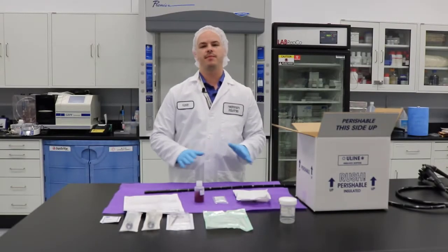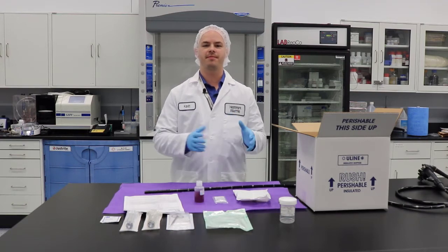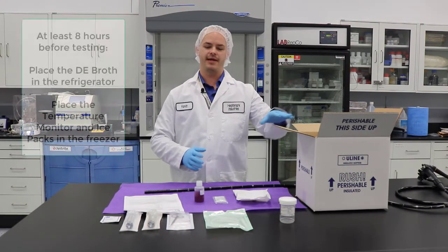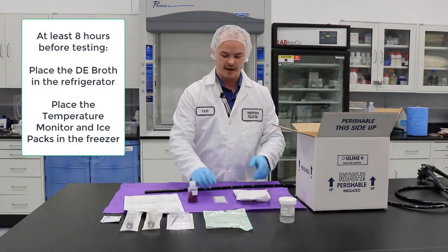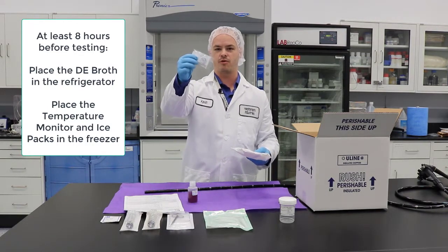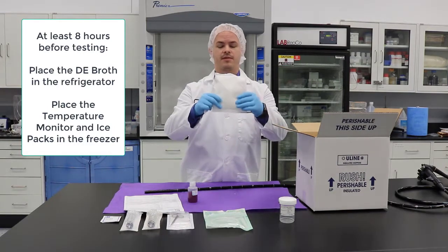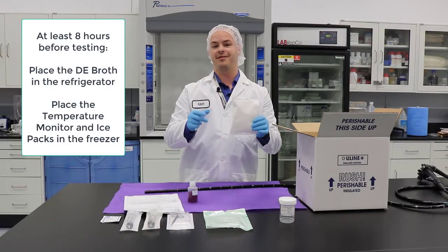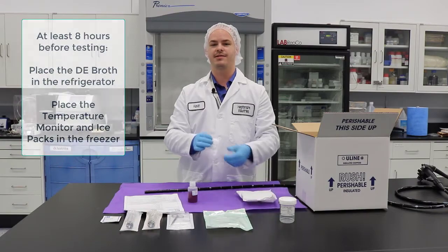Before we get started with the sampling procedure, we want to set you up for success from the get go. So when you get your box, we want to make sure that we take the DE broth out and put it in the refrigerator. You're going to have some other things inside that box — this is going to have to go in the freezer. These are freezer packs, and they have to be in the freezer for at least eight hours before you collect your sample and send it back to Nelson Labs.